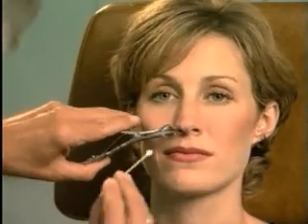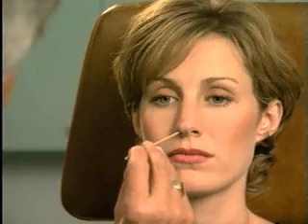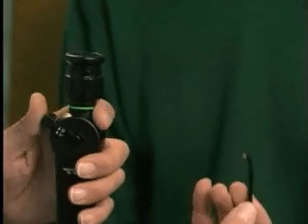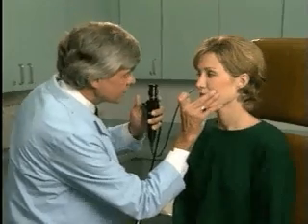The average exam takes about 4.5 minutes to perform. Here, we're starting with the right nostril. To minimize patient discomfort, the nasal cavity and throat should be anesthetized just prior to insertion of the instrument. Hold the control section in one hand while grasping the insertion tube between the index finger and thumb of your other hand. Lightly place your little finger and ring finger against the patient's cheek to help steady the instrument.